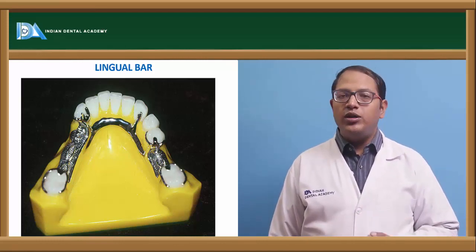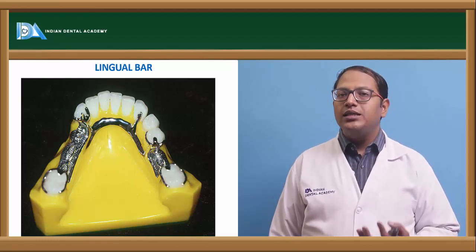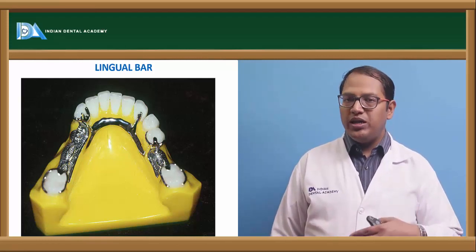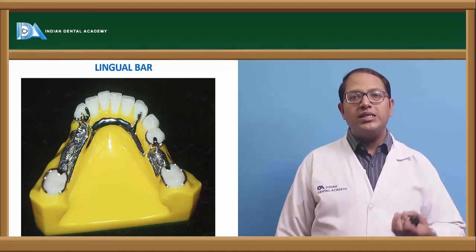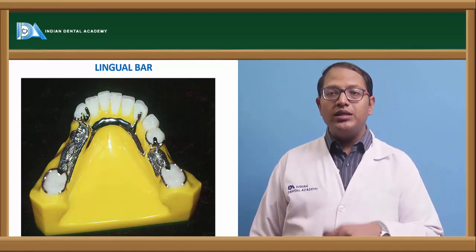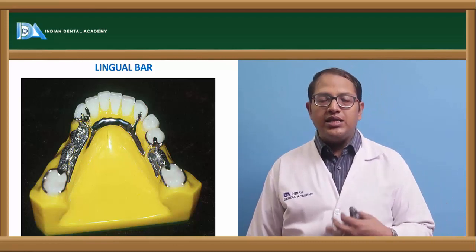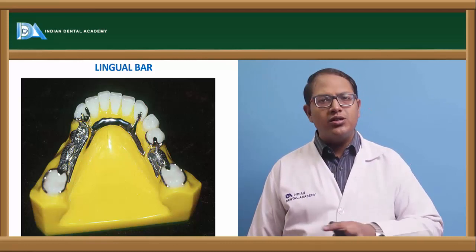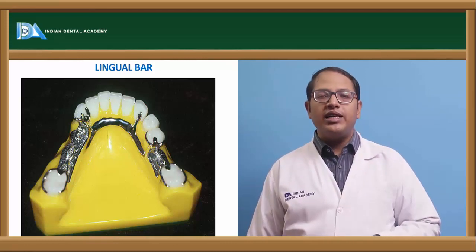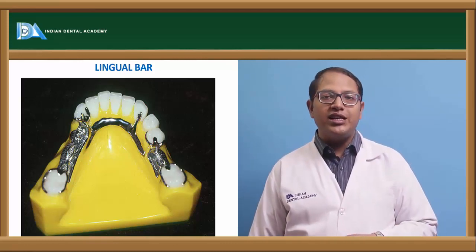Now, one more advantage of the lingual bar is that there is a space between the tooth, the free gingival margin and the lingual bar. So the attachment of food to the teeth, resulting in decalcification because of food debris accumulation, does not come into the picture. That is one of the greatest or major advantages with this kind of lingual bar.